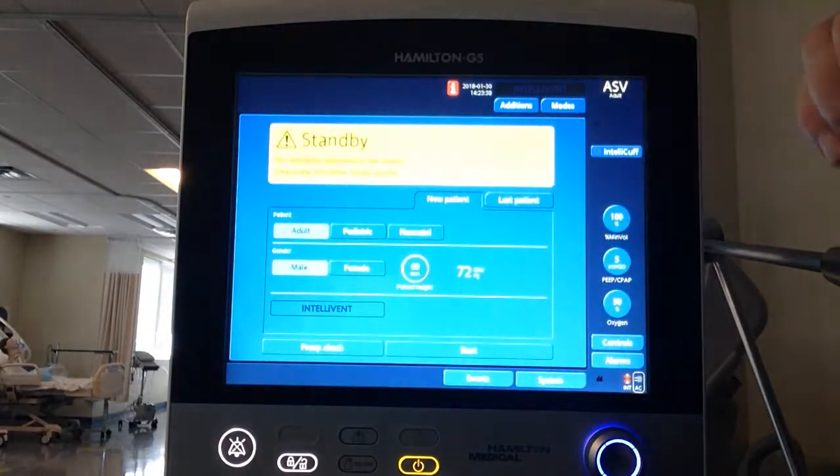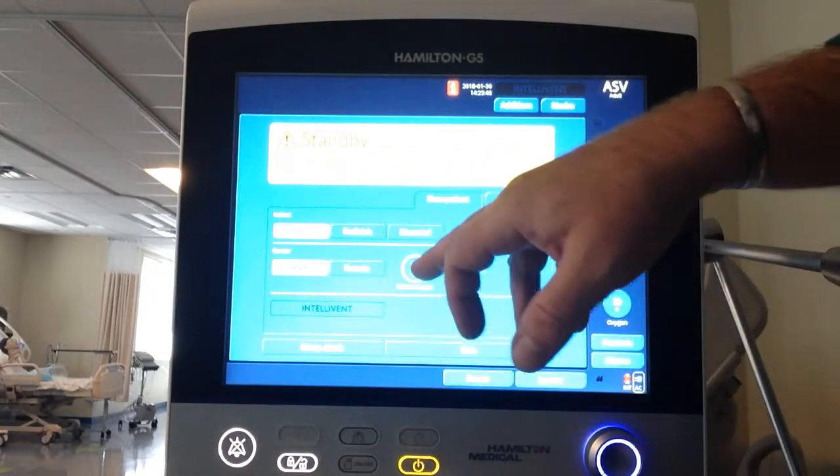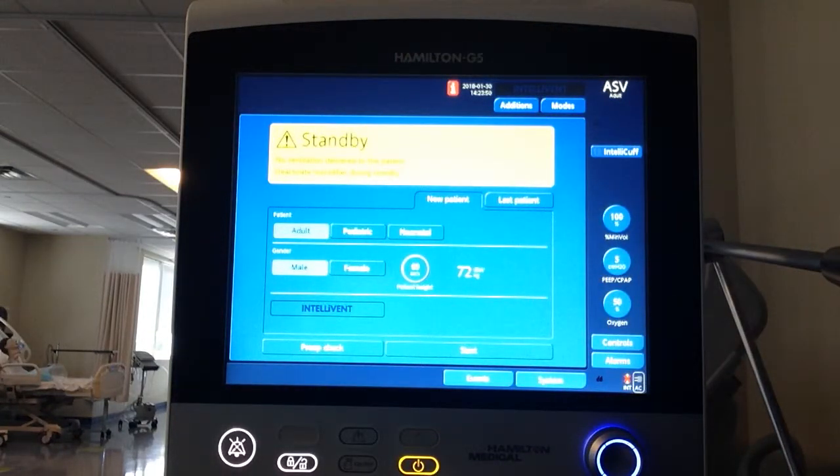This is where we typically choose our patient. Since we don't have a true patient, we're going to skip it, but if this were a new patient I'd select adult male or female, enter height in inches, and it would do my ideal body weight calculation for me.